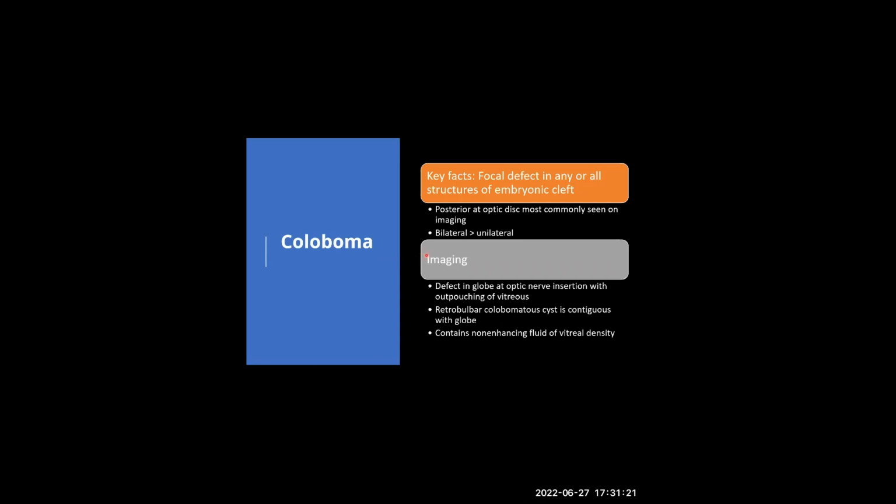I want these pathologies gathered in your mind without consequences, because the differentiating points between these pathologies are a bit remarkable. The advantage of the orbit is that for most of the pathologies you will have the key if you have some experience, some knowledge, and can also search well on the website.